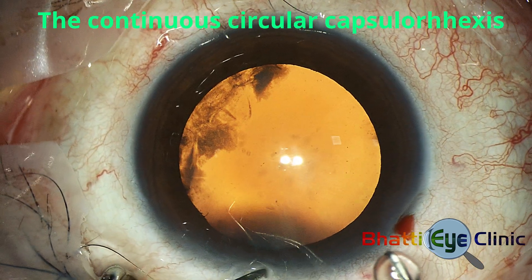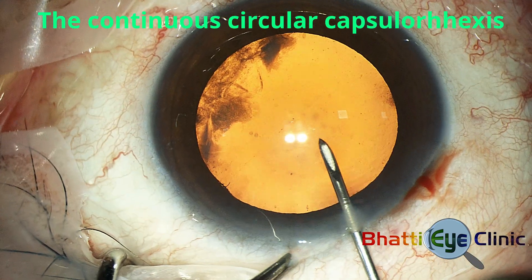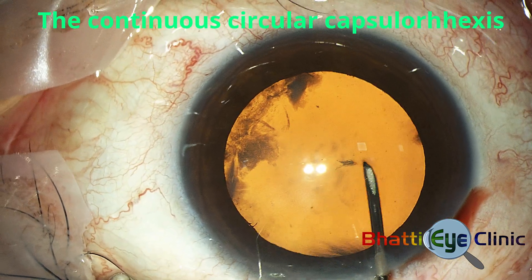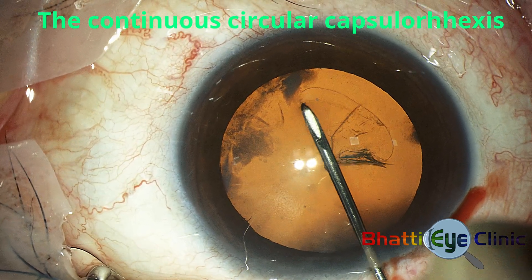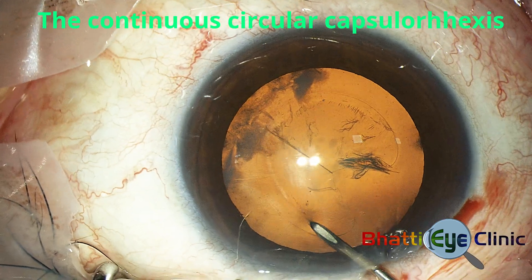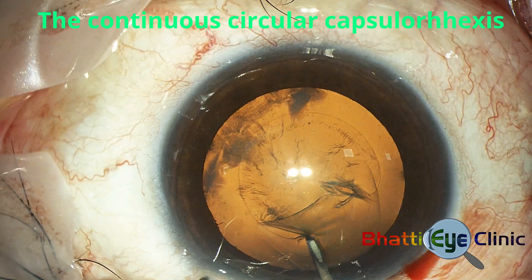Capsulorrhexis is performed using a 26-gauge needle bent about 30 degrees against the bevel. This is directly pushed into the anterior chamber and the entire rhexis is performed under aqueous, which gives a very stable anterior chamber as the entry wound is sealed by the needle bore. The needle first makes a radial incision which is pushed down at its peripheral extent to create a flap. The needle tip then holds and guides the flap in a circular fashion to complete the rhexis.